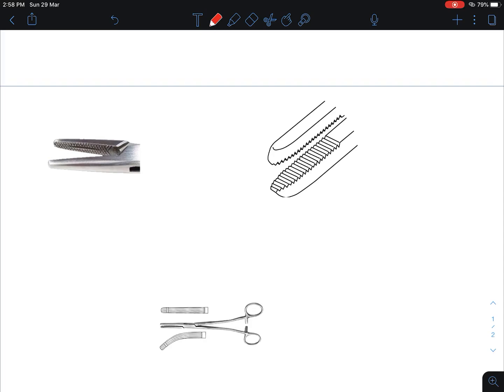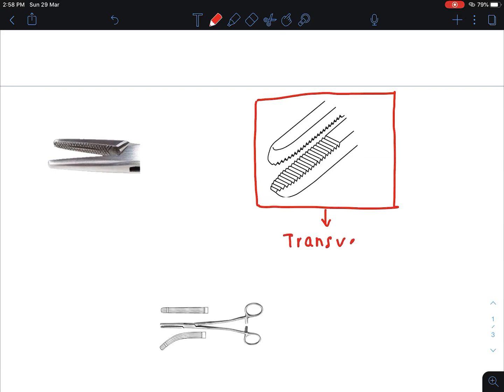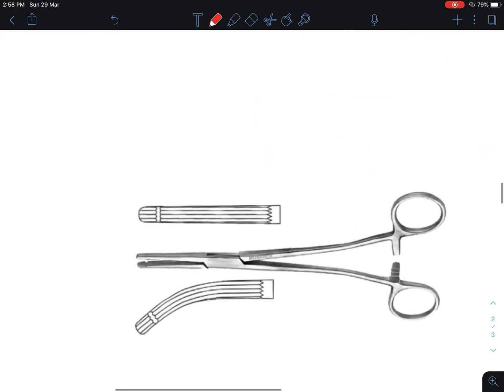Now I want to discuss the serrations of the surgical instrument. You can see there are three different types of serrations. The first type is transverse serrations. Transverse serrations are seen in artery forceps.